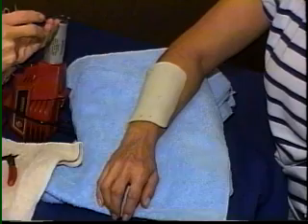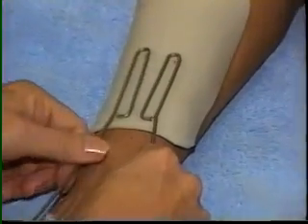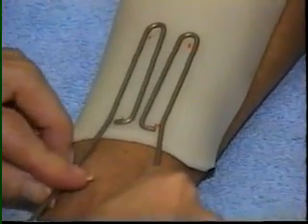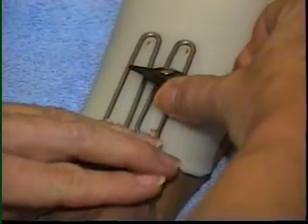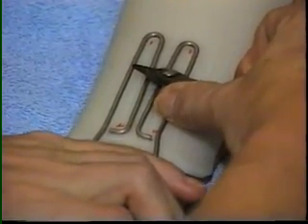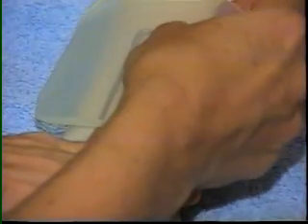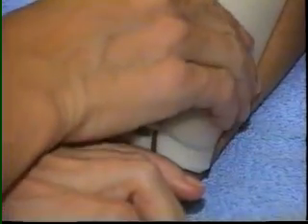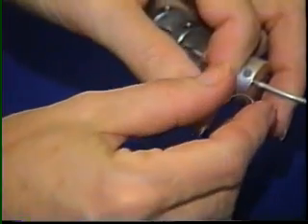The wire base of the outrigger is heated and lightly embedded in the thermoplastic where the location of the outrigger was marked. A layer of thermoplastic is bonded over the outrigger base. Rivets may be used to reinforce the attachment, but this is not essential if good technique is used in bonding.